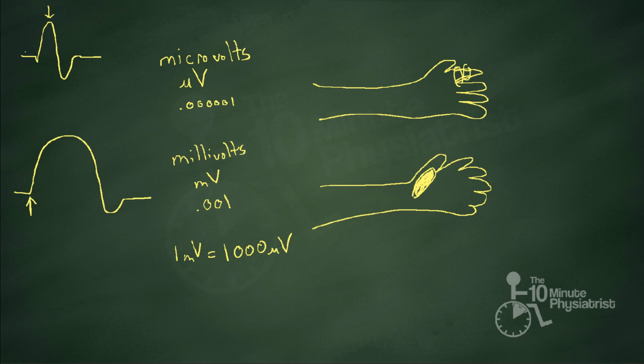You would see a tracing of this sensory nerve action potential, which was a very small potential, briefly phosphoresce across the screen, very rapidly fade, and the operator had to determine the size of that potential and also the latency of that potential in a bit less than a second, which is why historically we chose to use peaks instead of onset. The peak was just easier to see, particularly in a smaller potential.